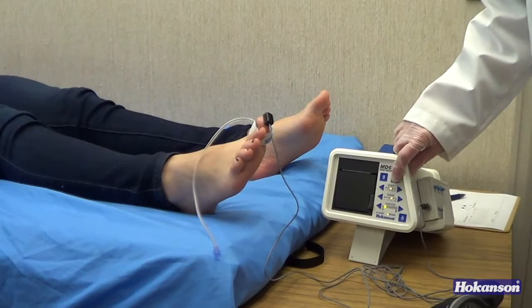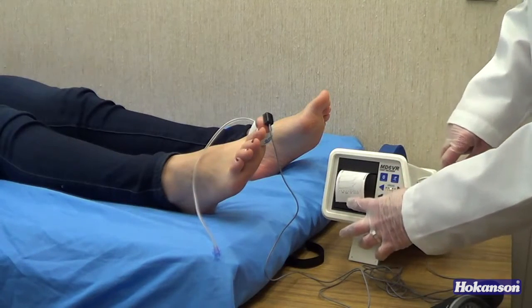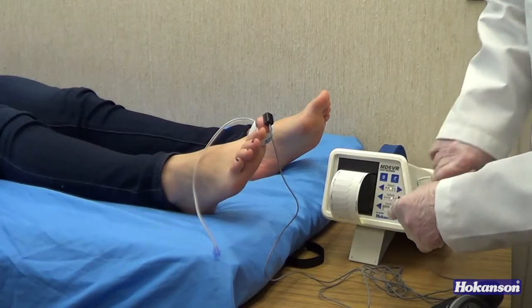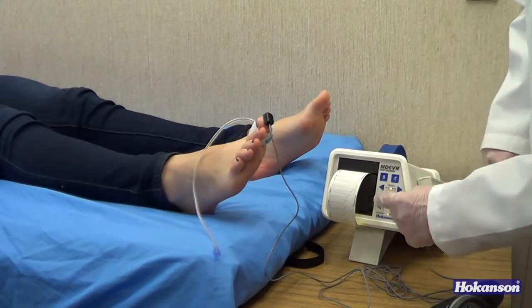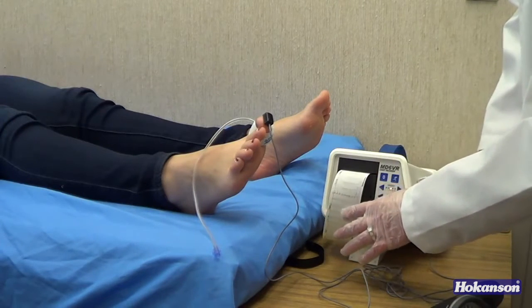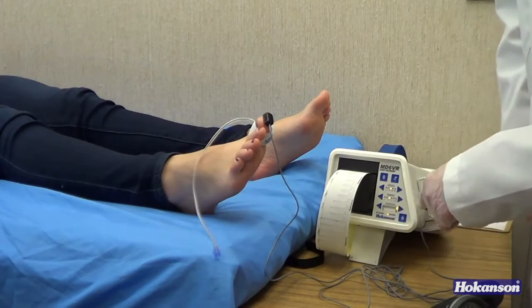So now we can print the waveform. We hit the run button. I'll move the waveform down just a little bit. You can see it's clipping off the top of the chart. And we'll actually make this less sensitive. Good. That is a very good representative waveform, and this is what we can use to document the patient's quality of flow to the toe.